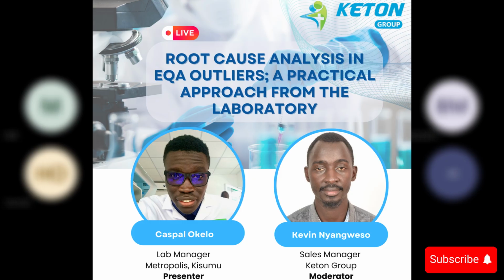Thank you very much, Violet, for your question. I mentioned the effectiveness monitoring. So effectiveness monitoring is measured by confirming that the problem does not recur and that the process performance improved, and also monitoring to show that the root cause was truly eliminated.